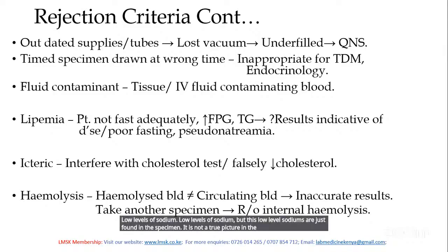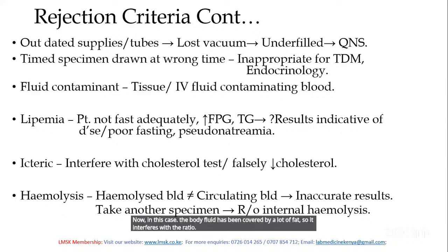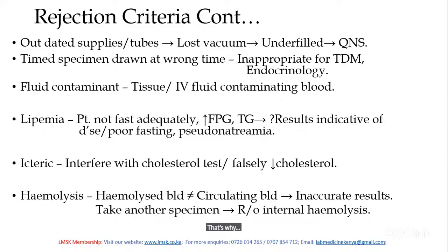That's why we call it pseudonatremia, because there are some analyzers that analyze the sodium based on the body fluid. Now, in this case, the body fluid has been covered by a lot of fat, so it interferes with the ratio. That's why you get pseudonatremia, so you avoid that.